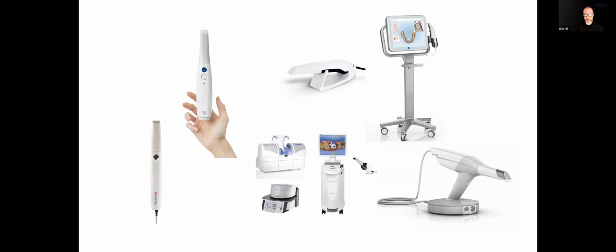If you're not getting good training from the manufacturer, I'd probably recommend not going with that manufacturer. So if you have a good discussion with them, you tend to like the software, but their training is not up to par, then I'd probably go a different route, simply because that training is absolutely key to getting good results. So make sure you're at least talking to that rep, get what that training schedule is. If it's not at least a few hours and potentially even in person, then I'd probably eliminate that from the pool of scanners to choose from.